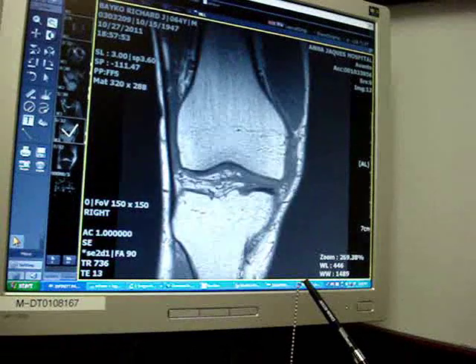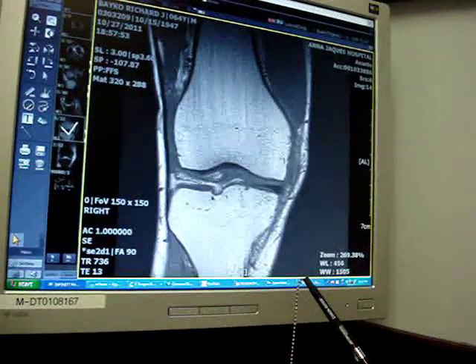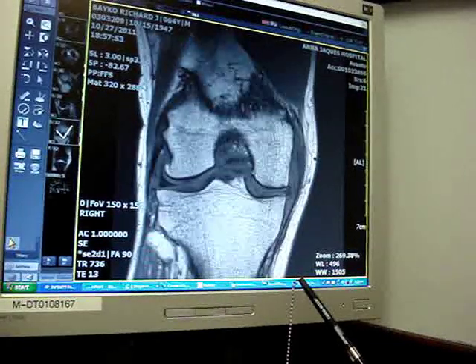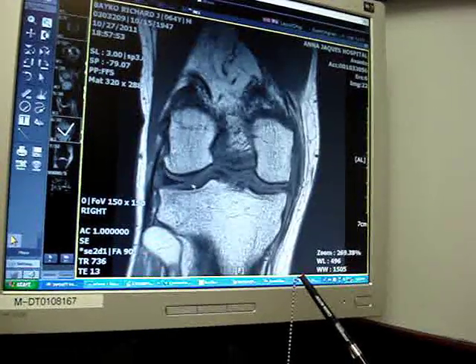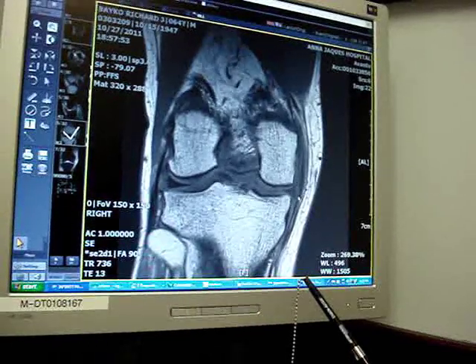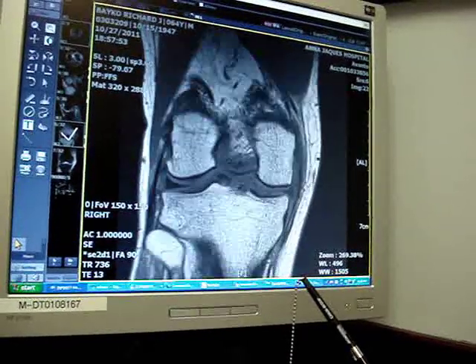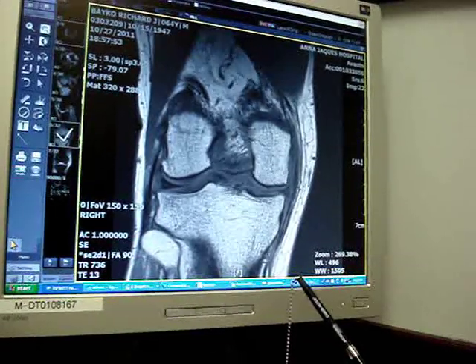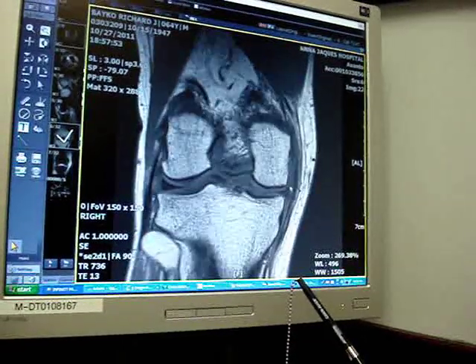And then here's a front view. When you look at this, the outside of the knee is here, the inside is there. You can see this meniscus — really nice sharp triangle — it doesn't look anything like it, does it? And again, you have a little irregularity to the joint surface — a little something right there — it makes me concerned, you've got some arthritis, but that meniscus is torn.